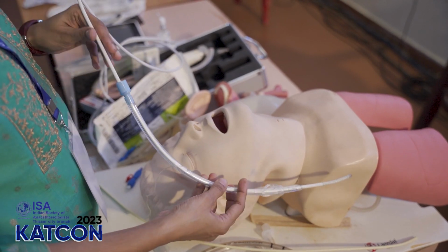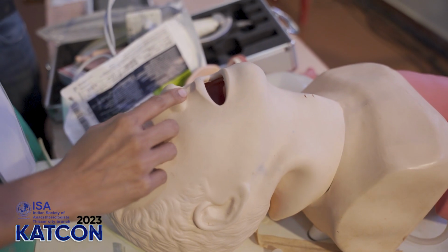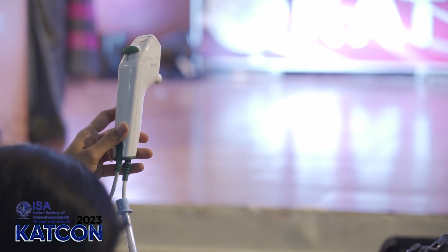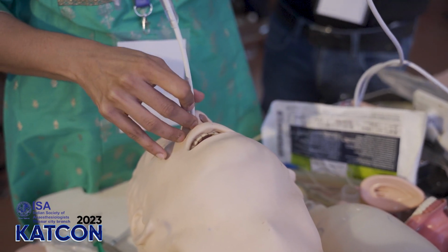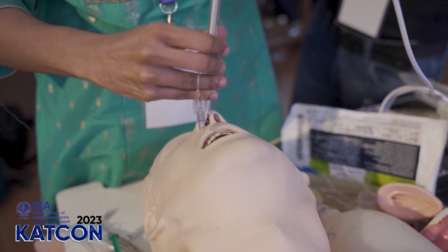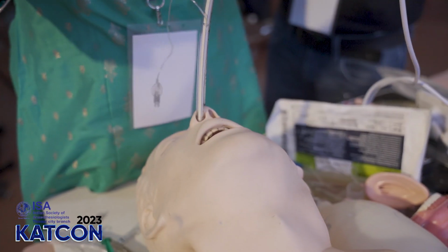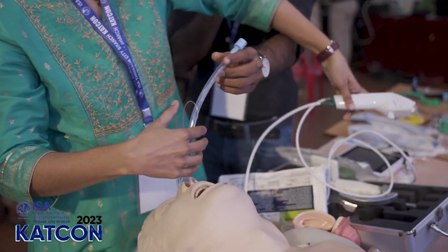The next step is the anesthetist will introduce the fiber optic scope through the nose or the mouth, usually through the nose, and she will enter into the larynx. After entering the larynx, the tube is railroaded over the scope, and then once it is visualized, you withdraw the scope, and the tube remains inside.